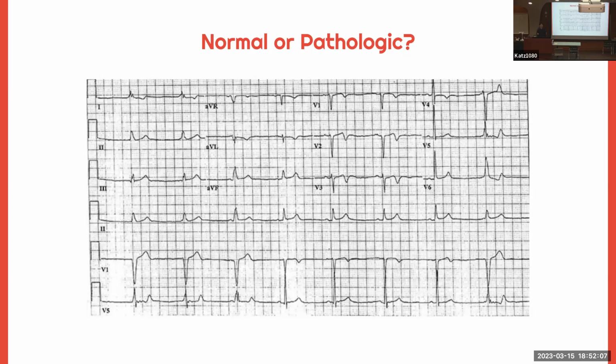So the reason ECGs are such a good modality for AI and ML is because, again, it's very much image-like in sort of the approach. You're able to take very classical features from this and extract them. The computer can deal with them very specifically and on a very minute scale that humans are unable to, and likely provide better diagnostic outcomes than clinicians are able to.